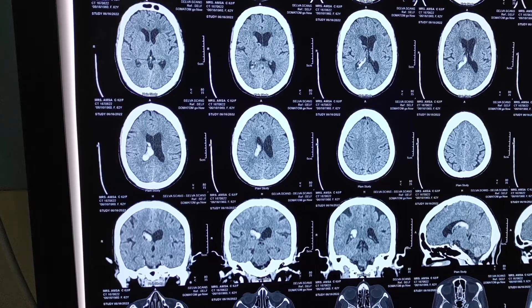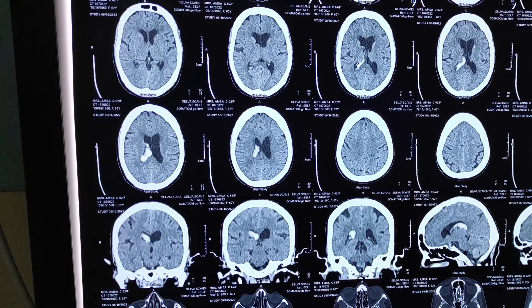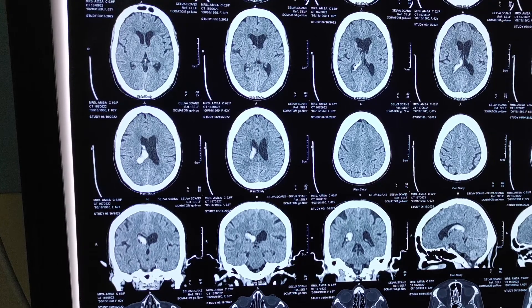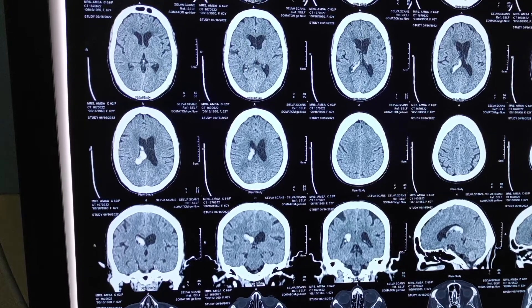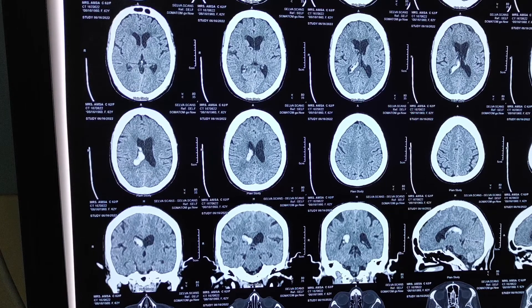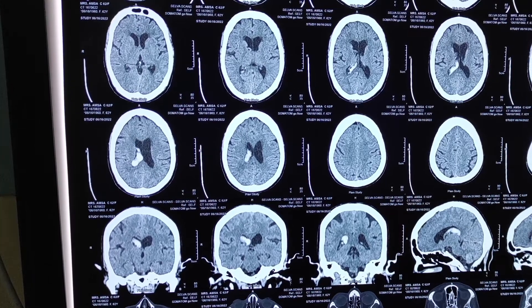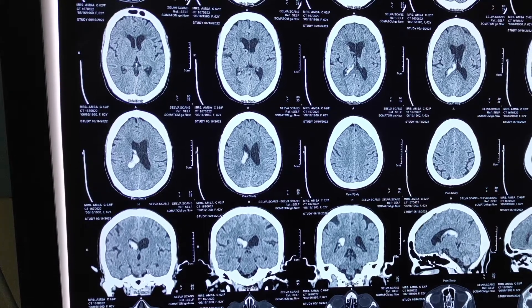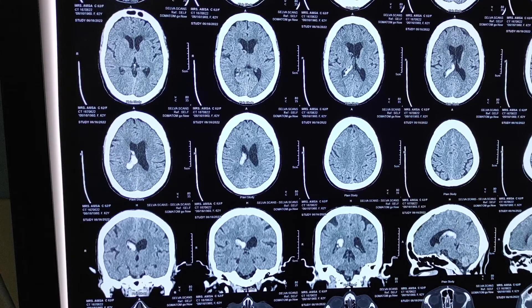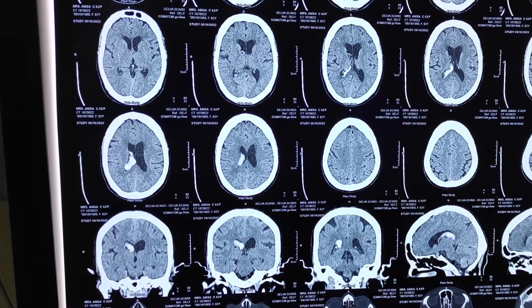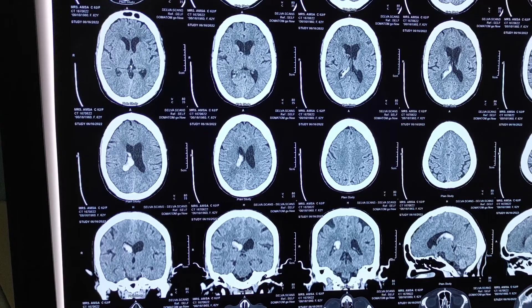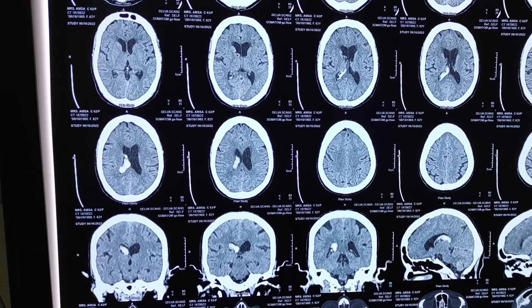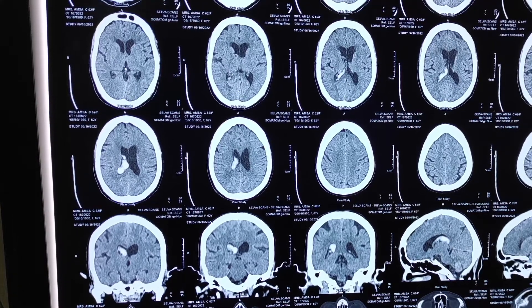In the CT images we can see hyperdense lesions — that is blood — in the ventricular system. There is no bleed in the parenchyma, so this is primary intraventricular hemorrhage without any extension into the parenchyma or subarachnoid space. This is a very rare case of isolated intraventricular hemorrhage.